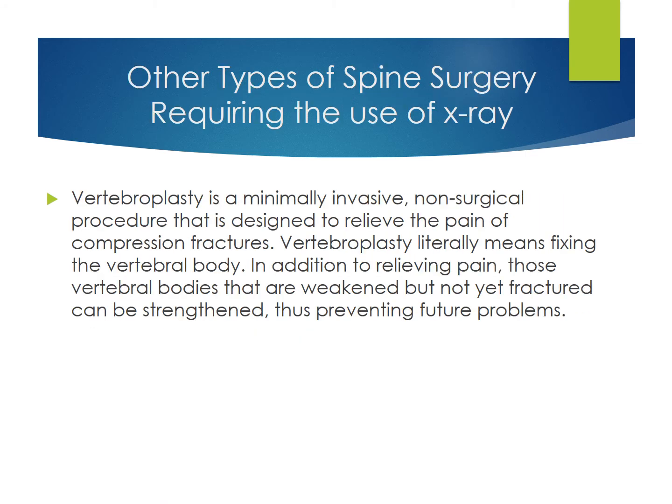Other types of spine surgeries requiring the use of X-ray. Vertebroplasty is a minimally invasive non-surgical procedure that is designed to relieve the pain of compression fractures. Vertebroplasty literally means fixing the vertebral body. In addition to relieving pain, those vertebral bodies that are weakened but not yet fractured can be strengthened, thus preventing future problems.